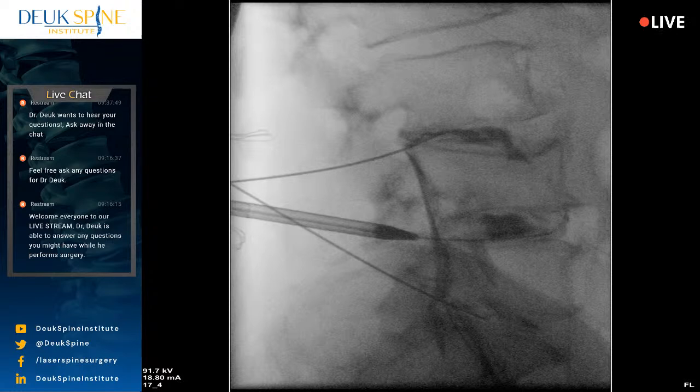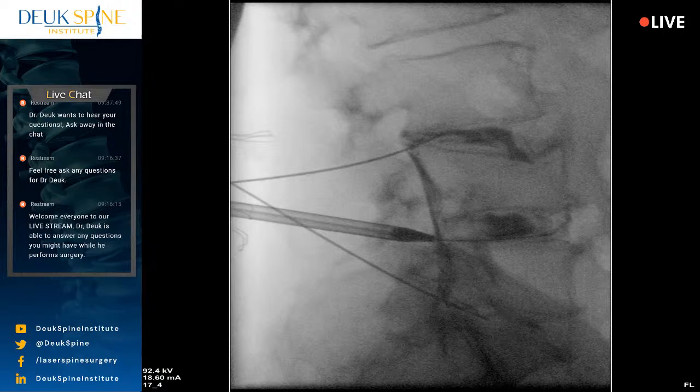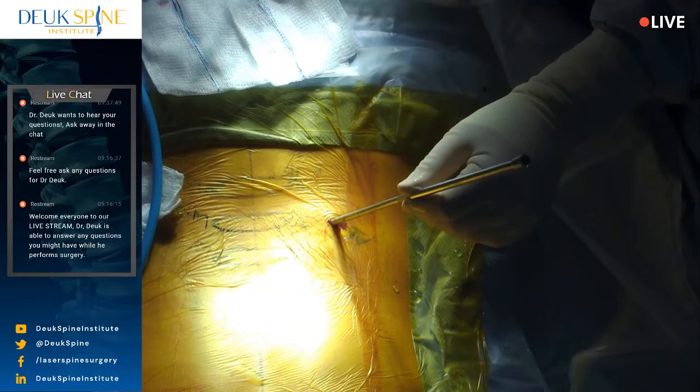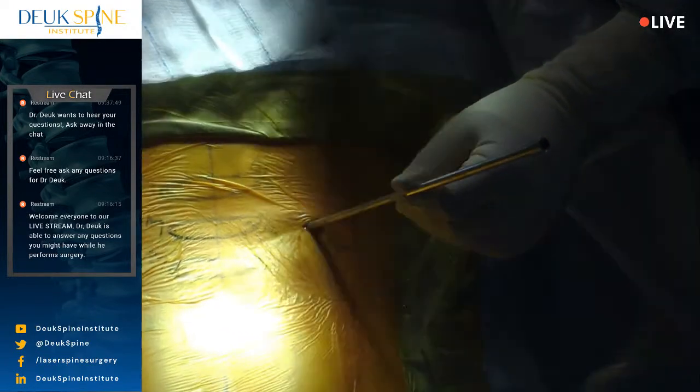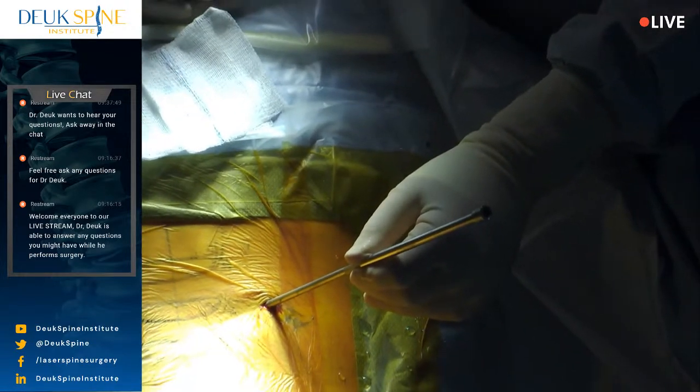So the inflammation happening in the back of the disc and the tear, those inflammatory mediators, cells, cytokines, interleukins, all that stuff, that inflammatory juice can spread, all right, and get on nerves and the thecal sac, and it can cause horrible pain. Now this patient has a lot of scar tissue here. I can feel it, okay? And that's probably why this disc didn't have a big tear, because it's mostly been healed. But we know that there's narrowing on this side that's impinging on the nerve root, causing some nerve damage. So we're going to go in there and fix that.